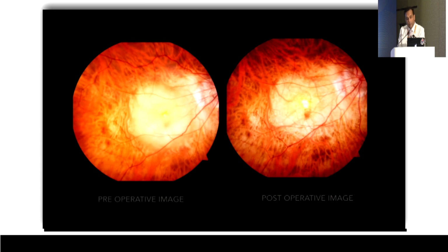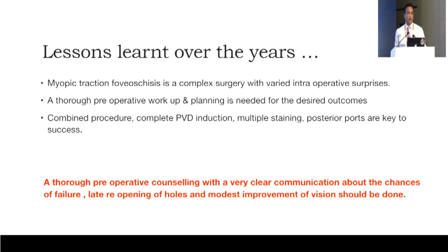This is the fundus picture pre-op and post-op. So to conclude, lessons learned over the years are that MTM is a complex surgery with varied intraoperative surprises. A thorough pre-operative workup and planning is needed.